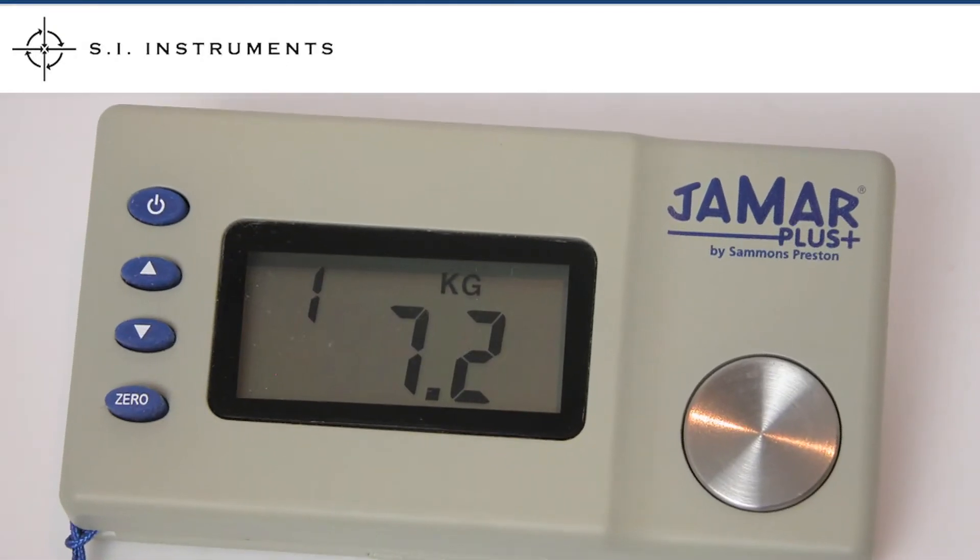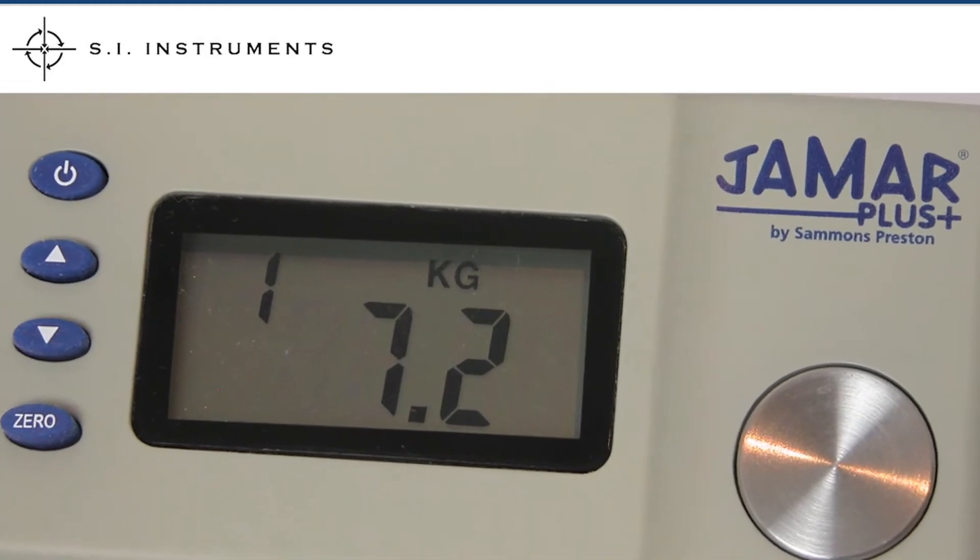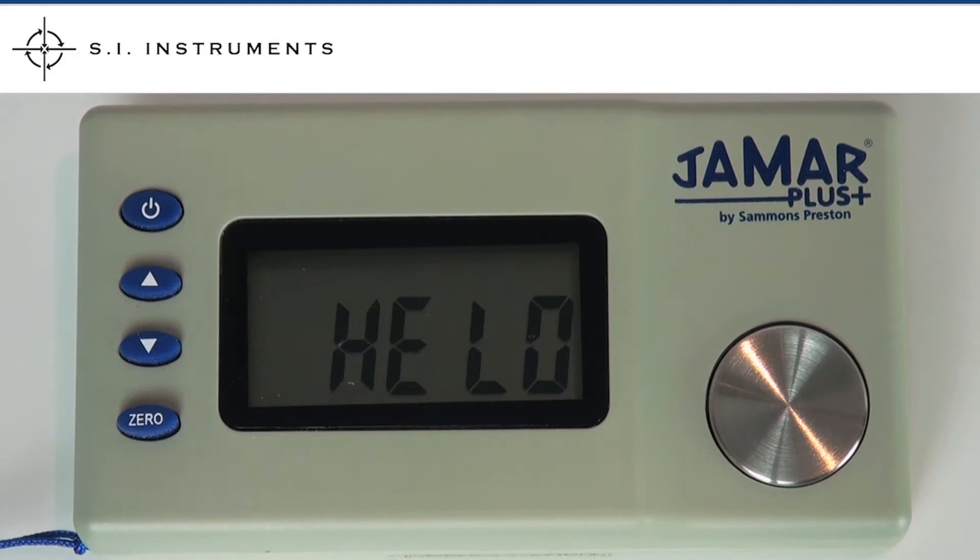The JMR Digital Pinch Gauge is a compact instrument for measuring pinch strength. Turning on the unit will run through a startup procedure, checking the calibration and the functionality of the gauge.